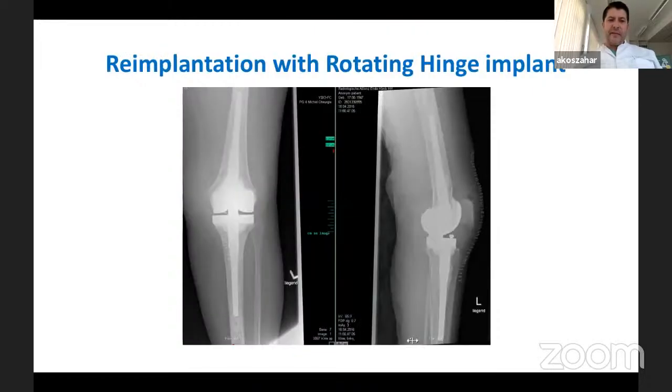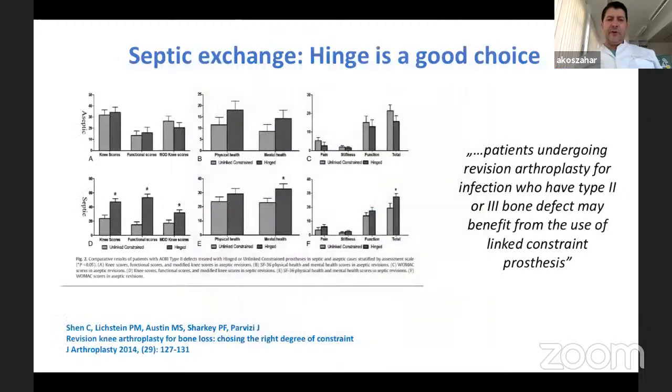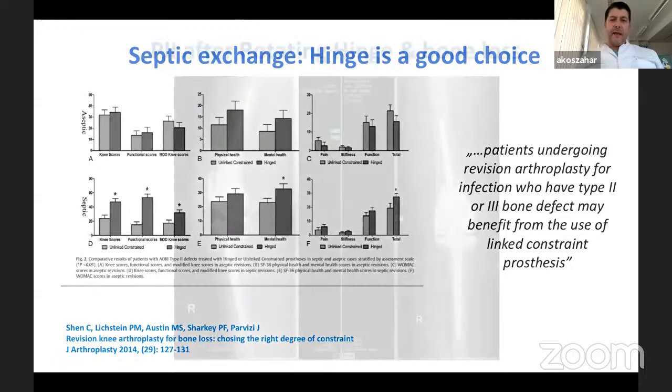In the total knee replacement, you go then for a reimplantation with rotating hinge implant. We prefer using the cemented implants. We prefer using the hinge in the knee because it's a good choice for the prosthetic joint infection. Why? Because you debride a lot. You remove all the soft tissues around the knee. Only the extensor apparatus is remaining, and the hinge is a good choice for intrinsic stability of the knee.